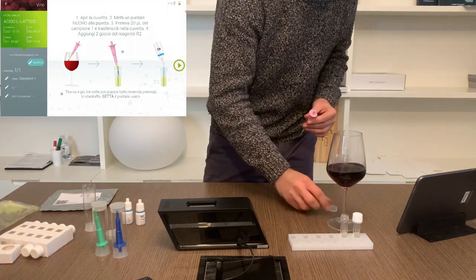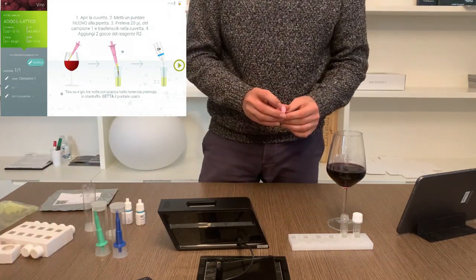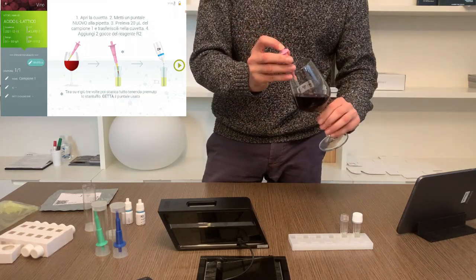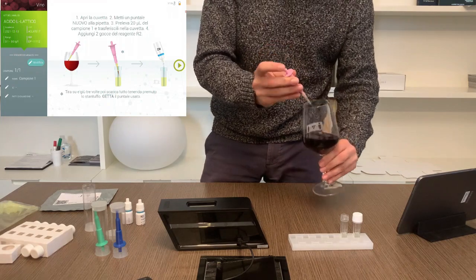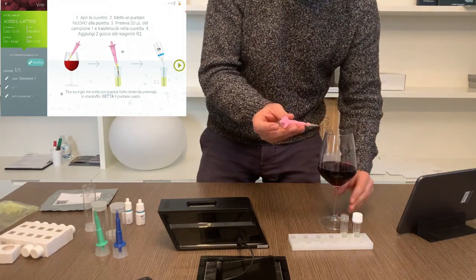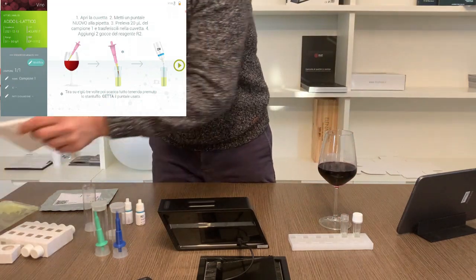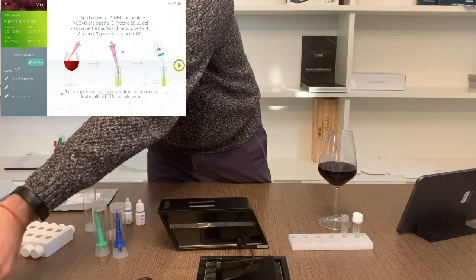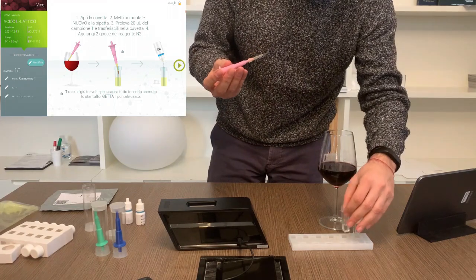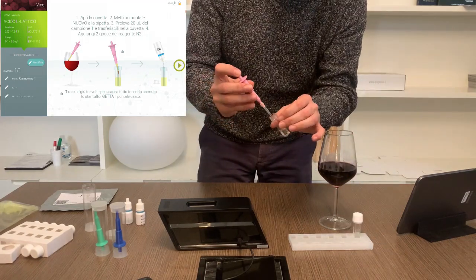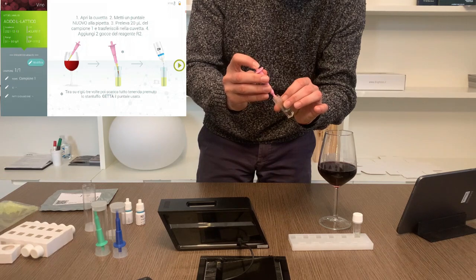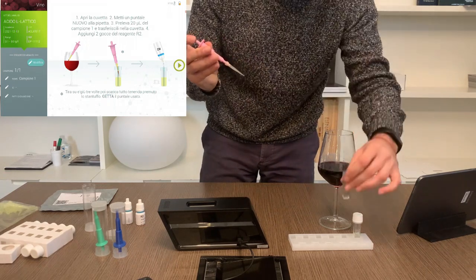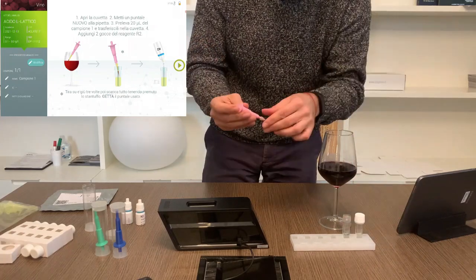Take your sample, press the plunger, dip the tip at least halfway into the sample and release gently. With a clean cloth or piece of paper wipe the outside of the tip to remove excess drops. Dip the tip into the reagent in the vial and press the plunger at least three times to mix the sample with the reagent. You can then throw away the yellow tip and continue.